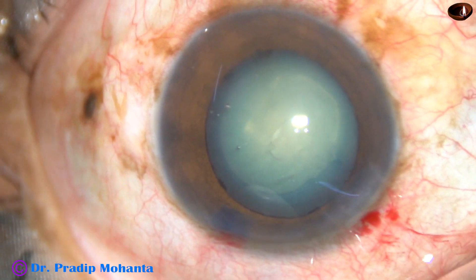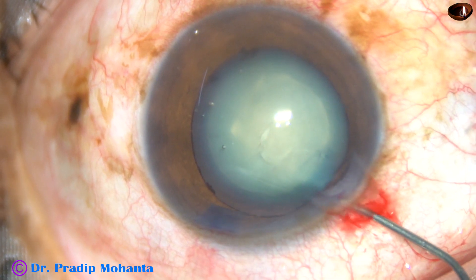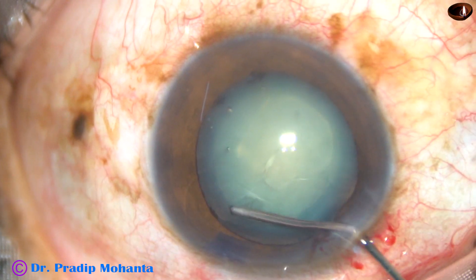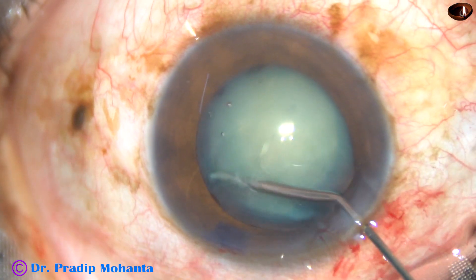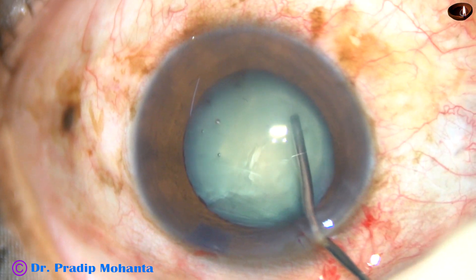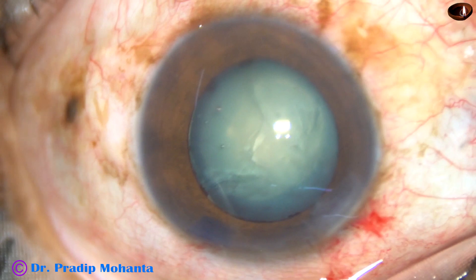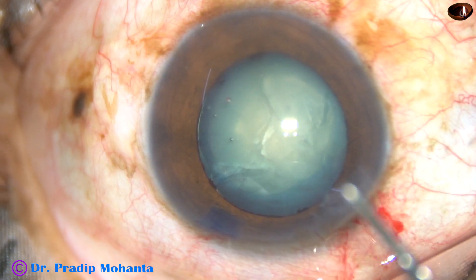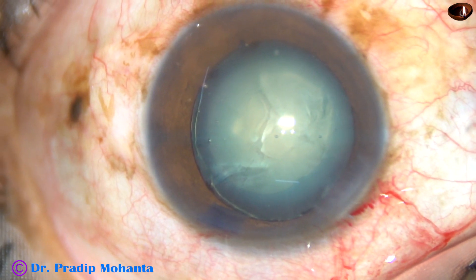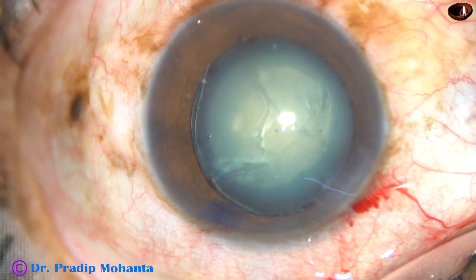Yes, rhexis has been done. Now in this case, I am not going to do hydrodissection. I am going to do hydrodelineation. Here it is — I am going to apply fluid inside the cortical matter, and it has separated the epinucleus from the nucleus. Hydrodissection has not been done, and so I am not going to rotate this nucleus. Without rotating, let us see how we can manage it.